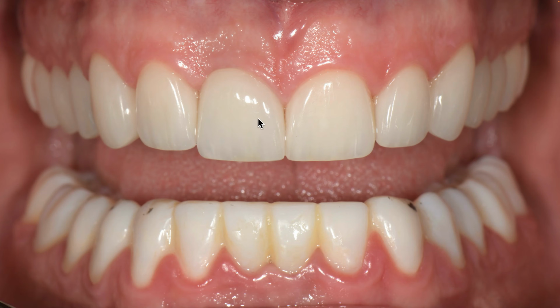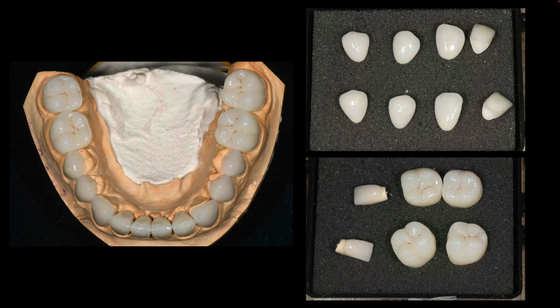Here's the final. This looks pretty darn close. It was close enough. It's maybe slightly lower in value if you make this black and white, but it's very close. And then you've got all the feldspathic, all the Emax matching, and then the zirconia at the back. So it's a mixed bag of materials.